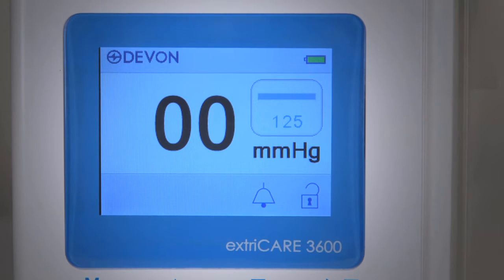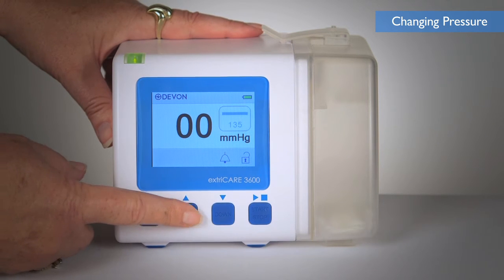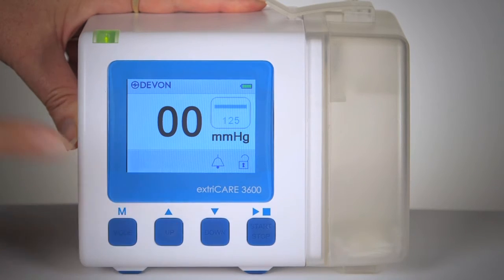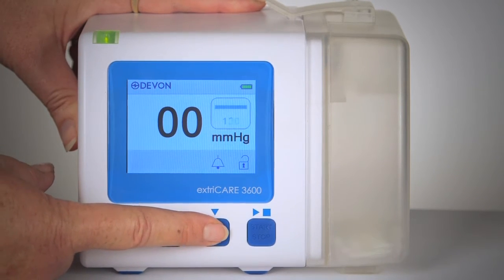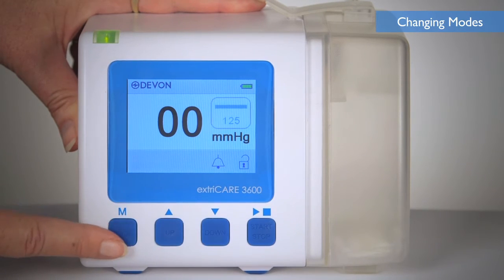The ExtraCare 3600 has a default pressure of 125 mmHg. To change the pressure, press the up or down buttons. The pressure will change in increments of 5 mmHg with a range of 40 mmHg to 200 mmHg. By holding down the up or down button, the pressure will change continuously in 5 mmHg increments.